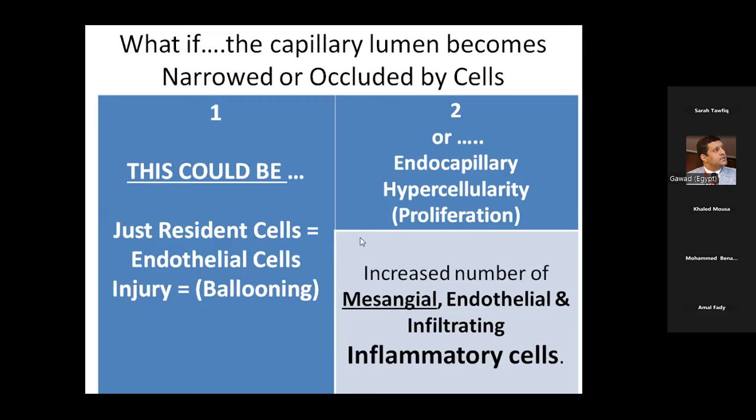Again, please, Dr. Muhammad. The endothelial cells in option 2 are the same as endothelial cells in option 1. Yes. The difference is that in situation 1, these are just an injured endothelium. Just an injured endothelium. Okay?